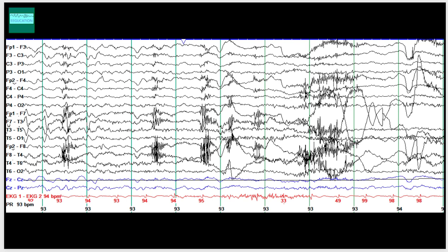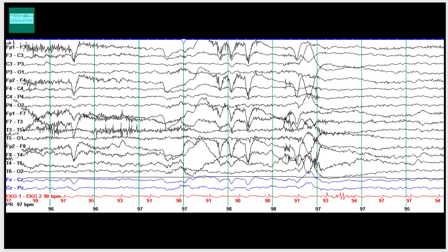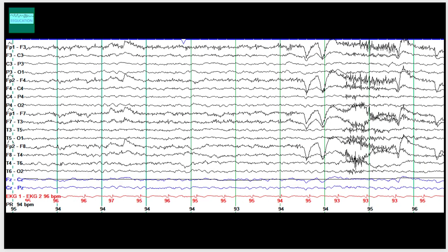On the next channel, you can see the end of the seizure. There are some muscle twitches — this is muscle artifact — the patient probably has some muscle twitches, and there is possibly some movement artifact, with fast frequencies superimposed on the background. This is 10 seconds after the seizure is over. You're still seeing some eye blink artifacts and low amplitude beta activity.